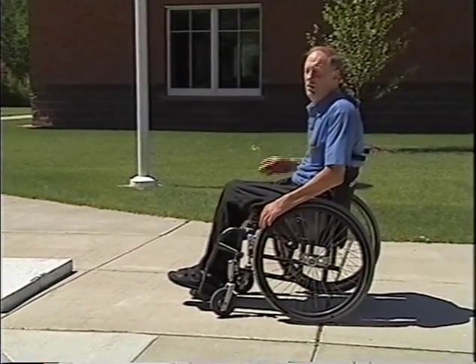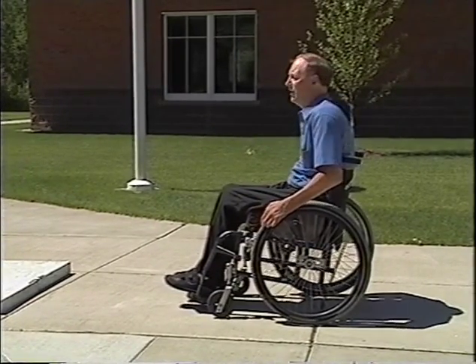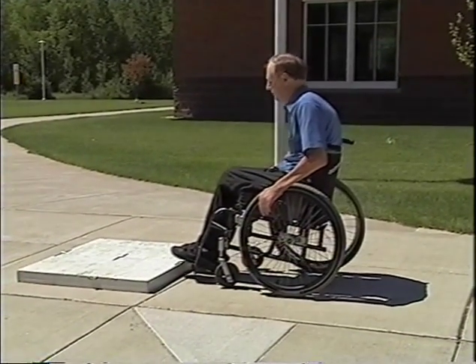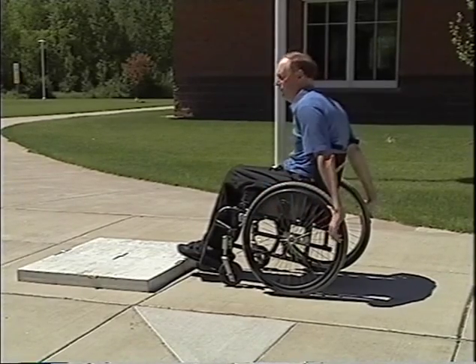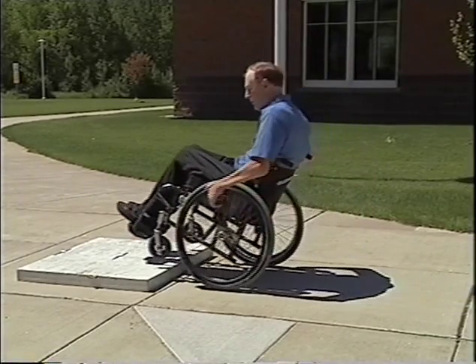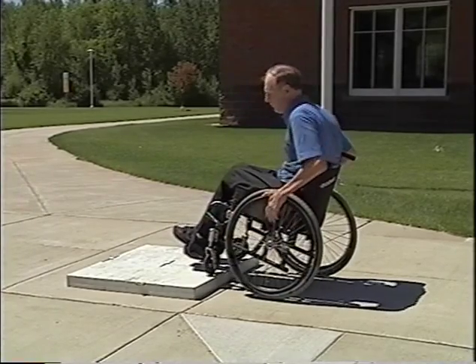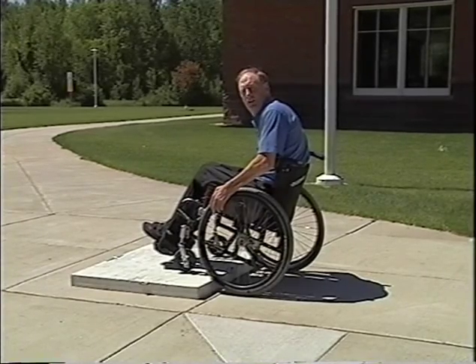Now that you've practiced jumping over the cracks in the sidewalk or lines in the linoleum, the next step is to jump up the curb. For that, you better roll up slowly. You see the curb between your toes — my front end is only a few inches away from the curb. You're reaching way back in a giant stride, picking the chair up. You want to land those front wheels on top of the sidewalk before your back wheel hits. You have a very small window of opportunity of about eight inches before that wheel contacts the curb.